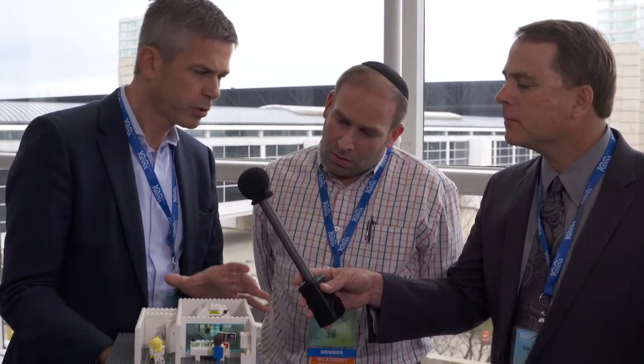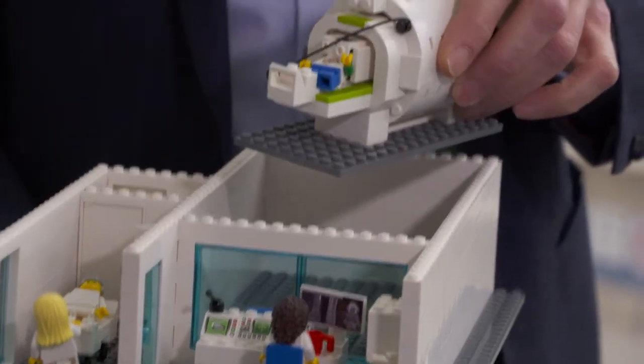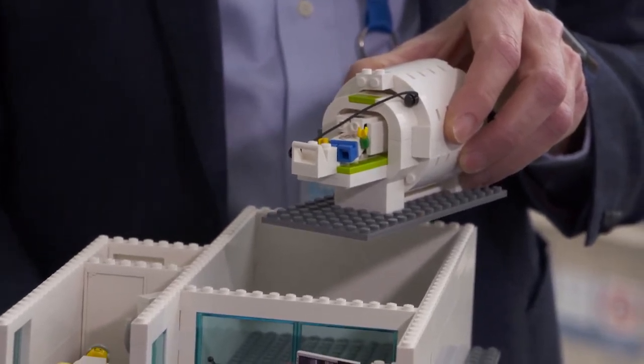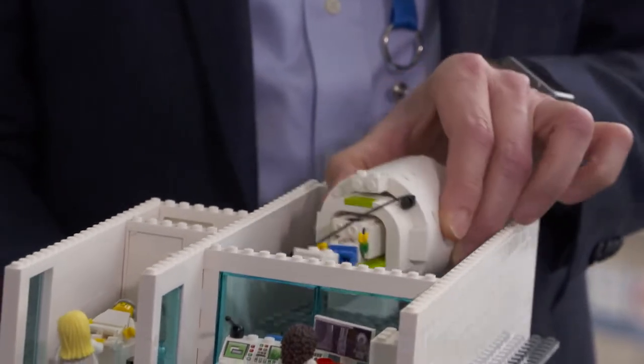The nice thing about it is that this is actually made of two parts. There's the big MRI unit and then there's a smaller one, which is the scanner. The idea is to provide this as a gift to children so that they can play with it before they undergo the examination, or even afterwards to help them overcome the experience of having gotten an MRI. So it makes it more interactive. This is one of the goals we would like to achieve with this model.